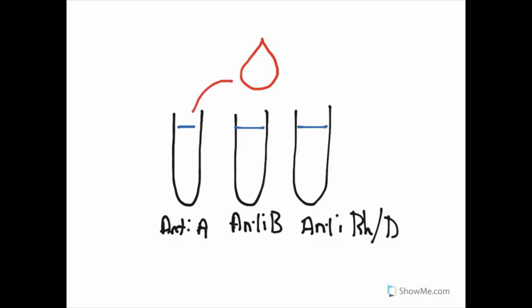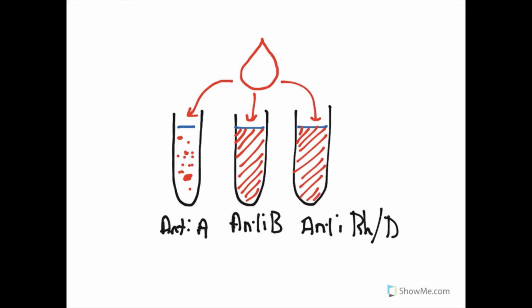And then I take this unknown blood and I add it. And here I get agglutinations here in A, but when I put it in B, it mixes without clumping, no agglutination. And when I put it in anti-RH or anti-D, nothing as well. So we already know this is A, but it is A negative. It is negative for the RH antigen.